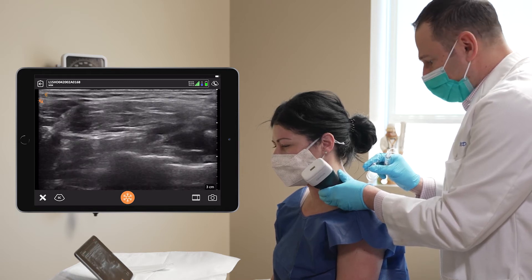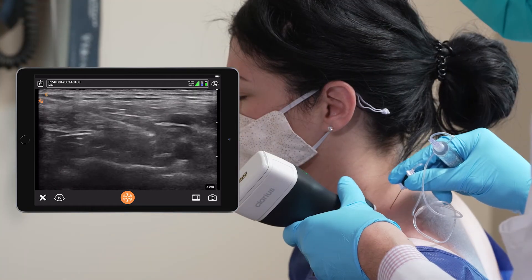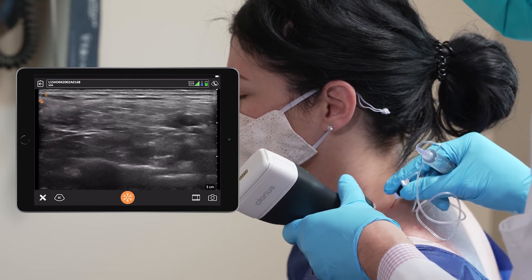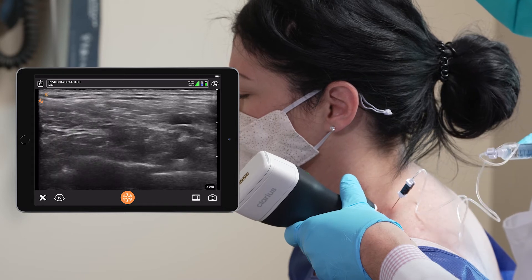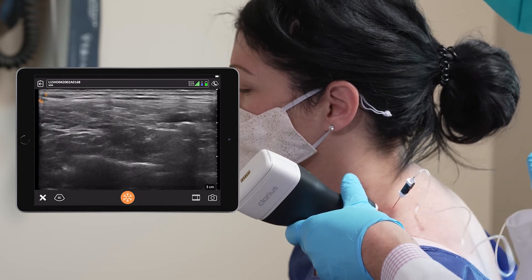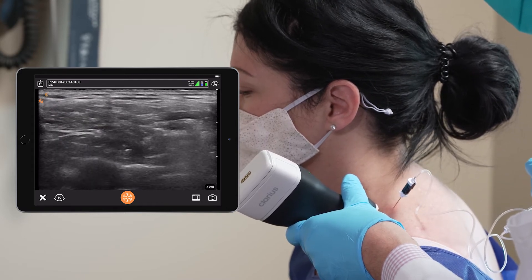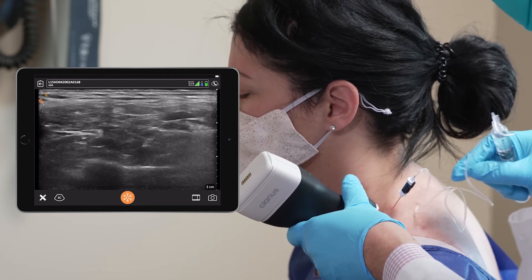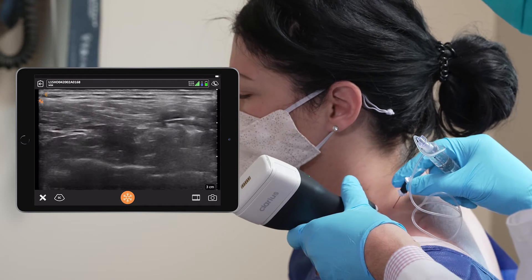The needle is right inside, getting close to the nerves in your hand. You may feel something shoot down the hand. Feel that? Is it going into your arm? Is it where your pain is? Yeah, I think so.